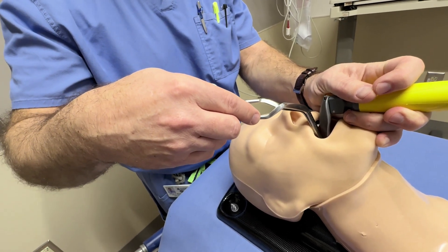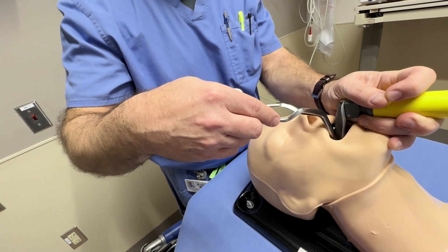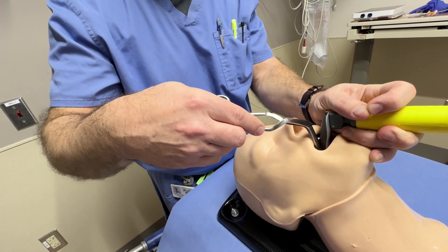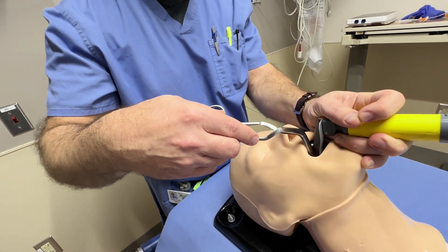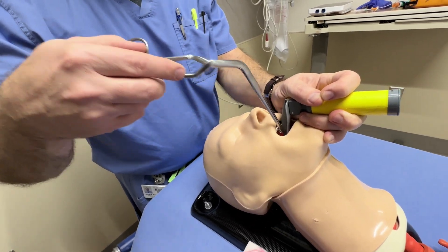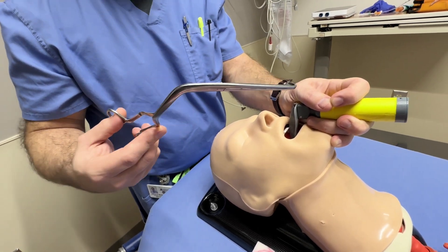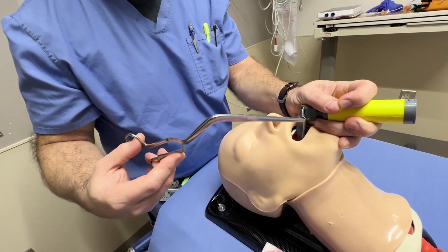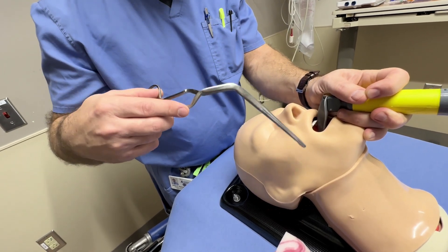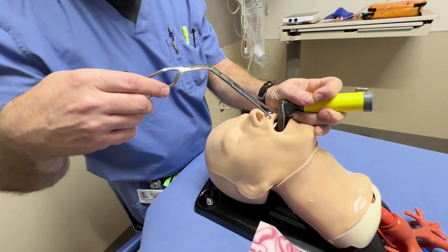My hand is not obscuring my view whatsoever, and I can easily grasp whatever foreign body it may be. That's a very important point, because so many times we try to manipulate using the McGill in different hand locations — try from below. But you're recommending just come from above. It's designed to be a head-of-bed instrument. If you use it any other way, then your hand is going to be in the way.